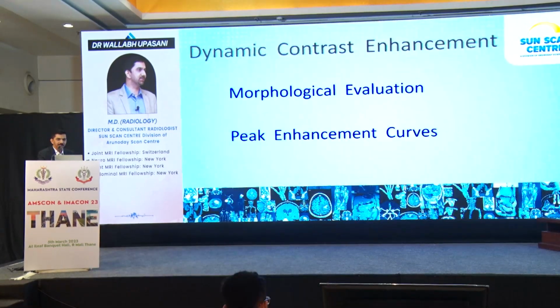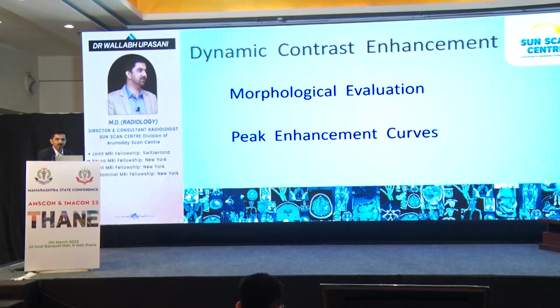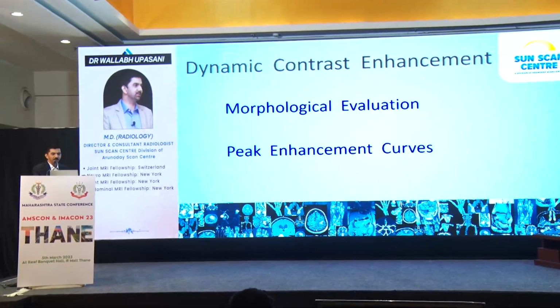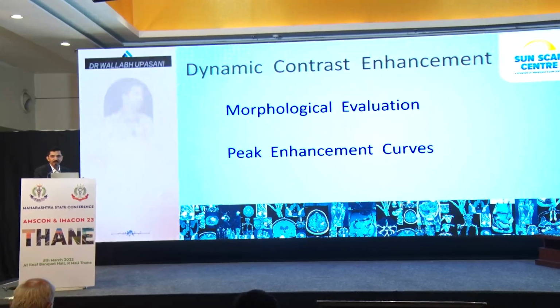And when we get these images, they help us in morphological evaluation. Like we can see in the images how the lesion is enhancing, and we can evaluate the lesion with what we call peak enhancement curves.